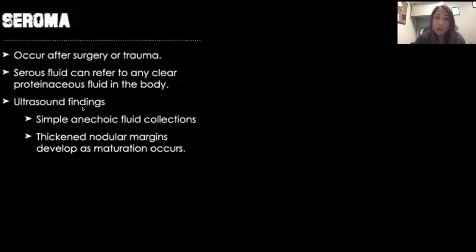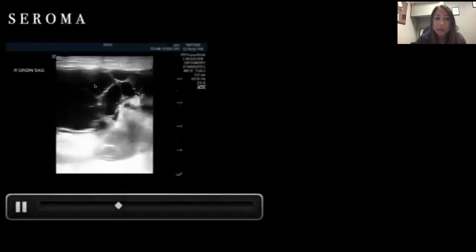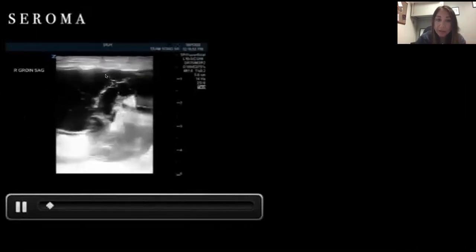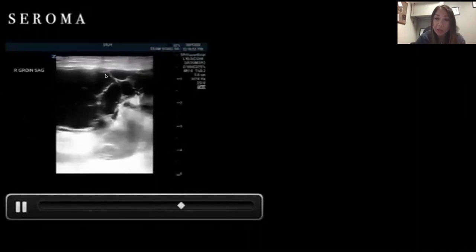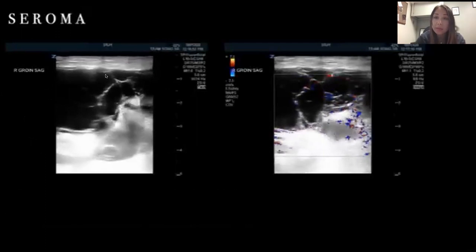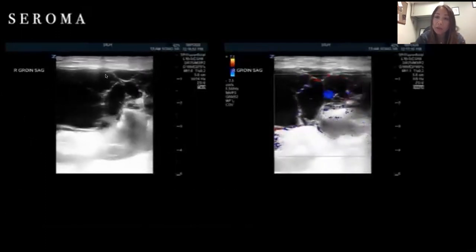Seromas usually occur after surgery or trauma. They're made of serous fluid and can refer to any clear, proteinaceous fluid in the body. On ultrasound you'll see anechoic fluid collections, and as they mature you can have nodular margins — it's not clearly an abscess, but it starts developing clear margins. Sometimes you'll also have increased vascularity, so if you put color flow on it, you'll see increased flow.